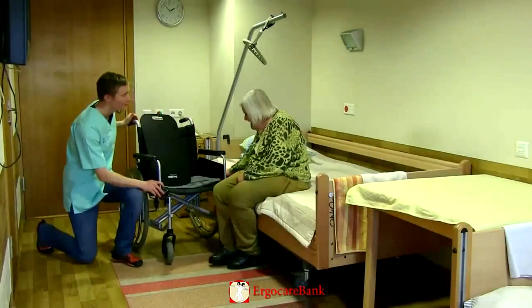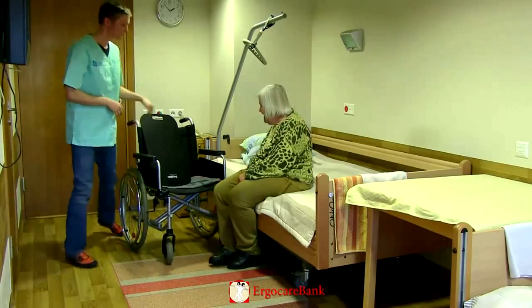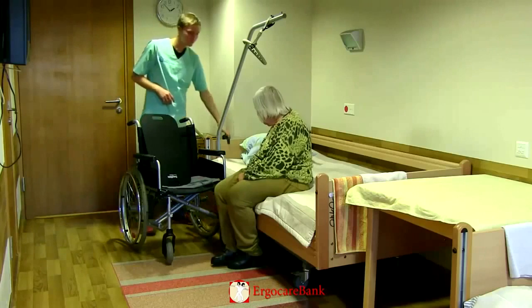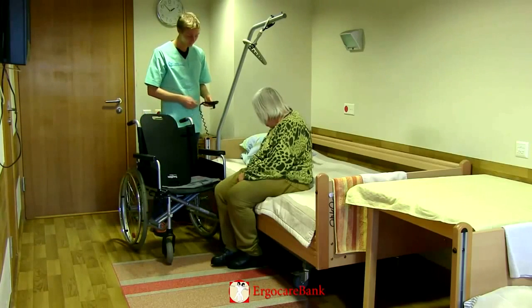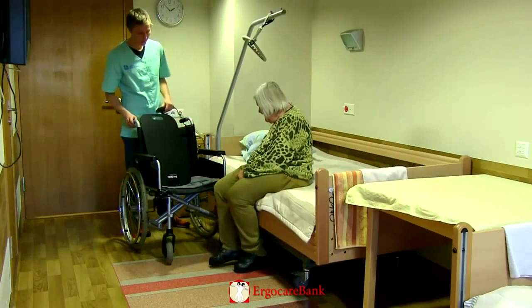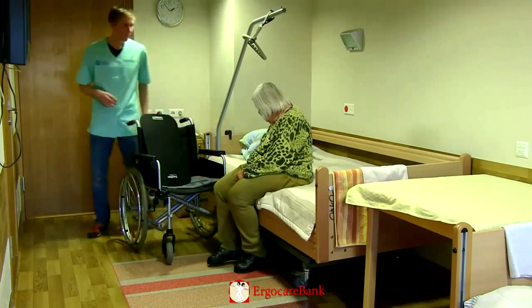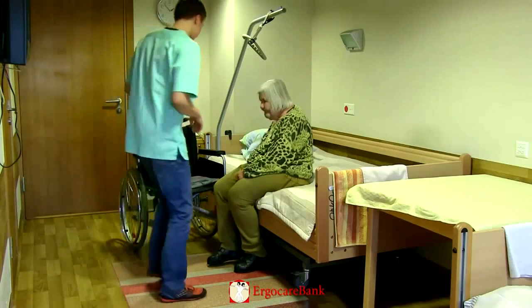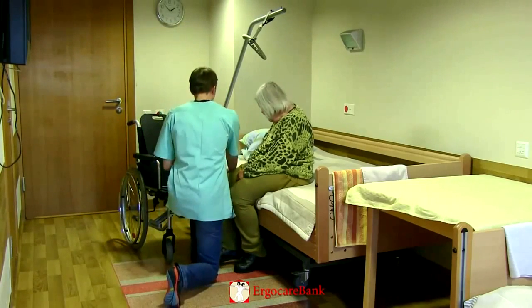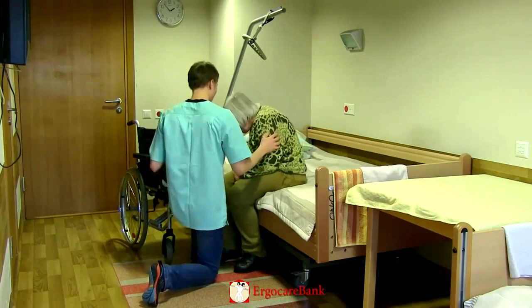The staff member prepares the transfer by angling the wheelchair to the bed, putting the brakes on, and raising the bed so that it's higher than the seat of the chair. He removes the closest armrest of the chair and asks Christina to lean away from the wheelchair so that he can place the slide board partly under her buttock.